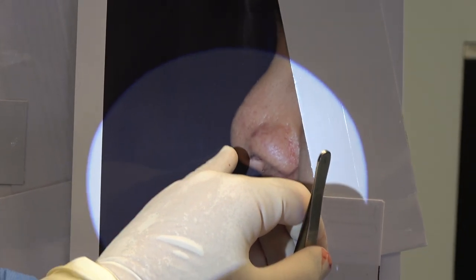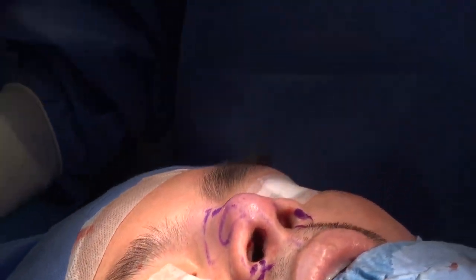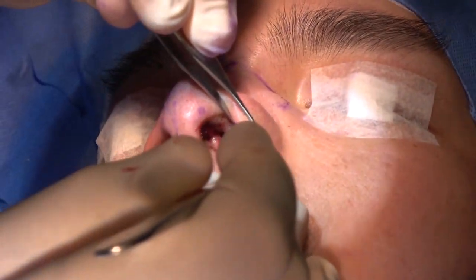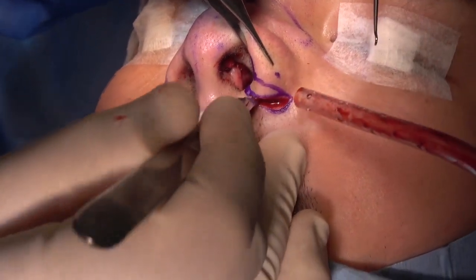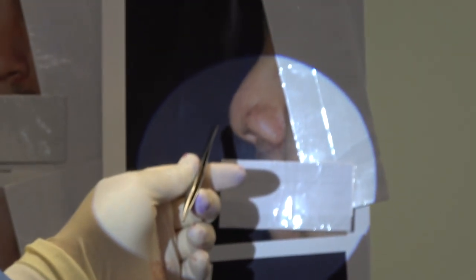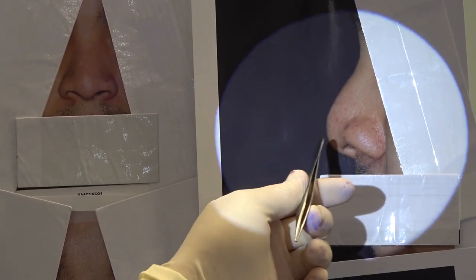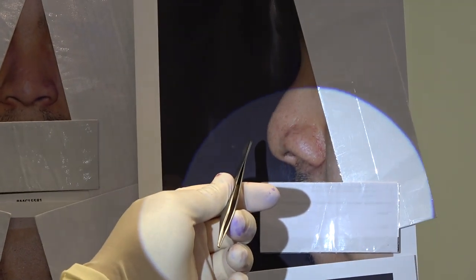The patient has a very, very depressed tip, as you see. We already have three tip grafts and still not enough. After I finish, I will go back to the ear and take another graft, making four grafts. But let me do this alar wedge resection first and see what I can do about it. So three tip grafts are still not enough to manage this severely depressed tip, as you see, and it is pushed against the glass of the window. Severely depressed tip.